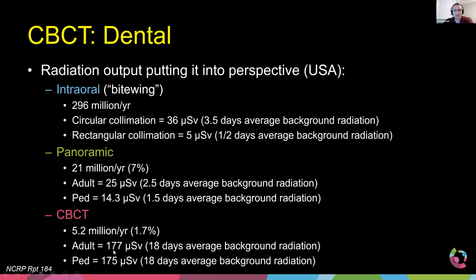Part of that is because, as we all know, bones and teeth are, for example, by the time we're about 8 or 9 years old, as ossified as they are when we're adults. So when it comes down to imaging teeth and the bones in the jaw, there's really no distinction between a kid and an adult. That, and our faces grow logarithmically. So usually by the time we hit 8, 9, 10 years old, our faces are approaching about the same size as the face we would have the rest of our adult life. And so that's why there's very little modification when it comes to this.